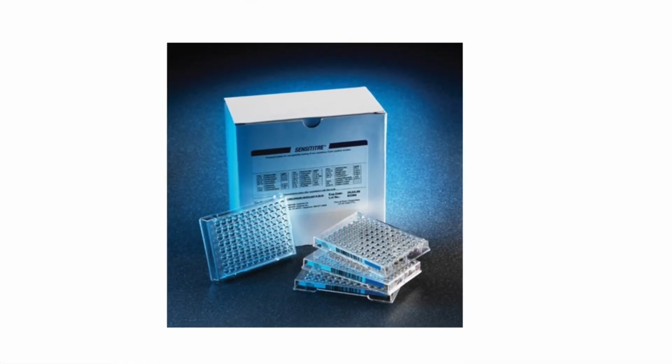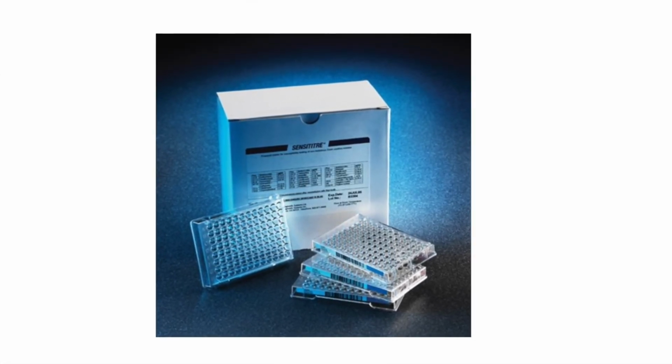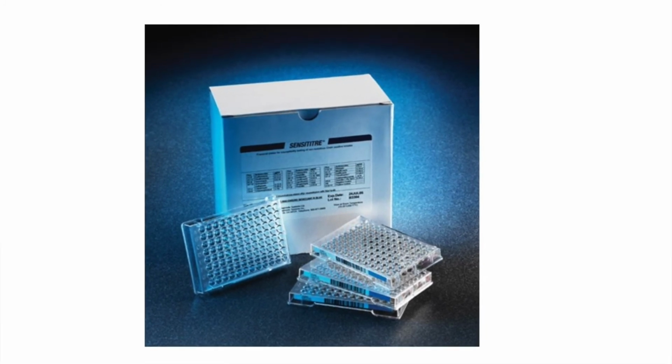Now in practice, in a diagnostic lab, we purchase these plates pre-manufactured to meet our needs within veterinary practice. When we purchase the MIC plate, it already has specific antimicrobials placed into those wells at increasing concentrations. You can get a variety of different plates depending on the types of antimicrobials we are most likely to use in the specific case we're evaluating.